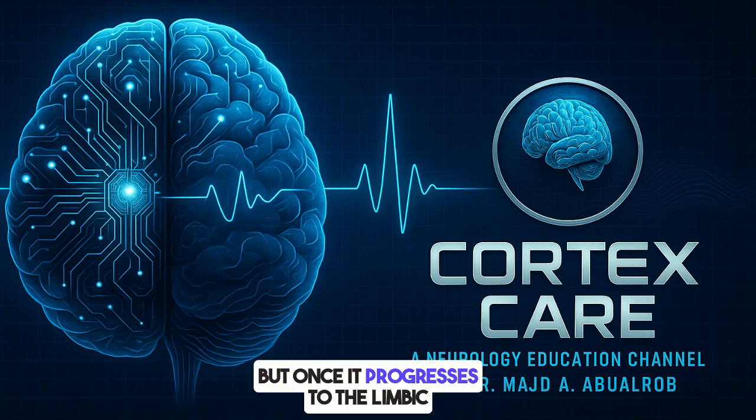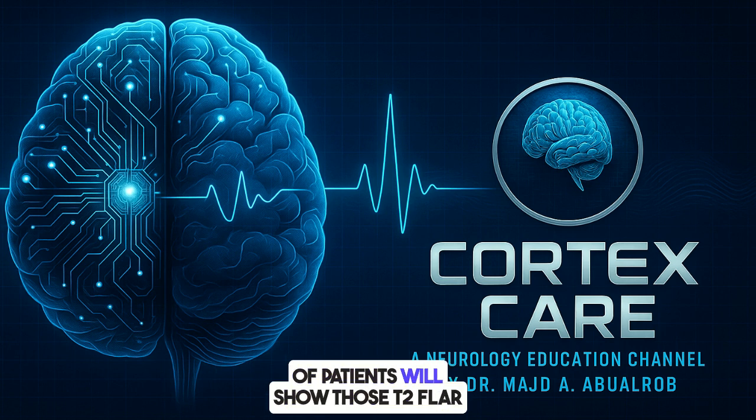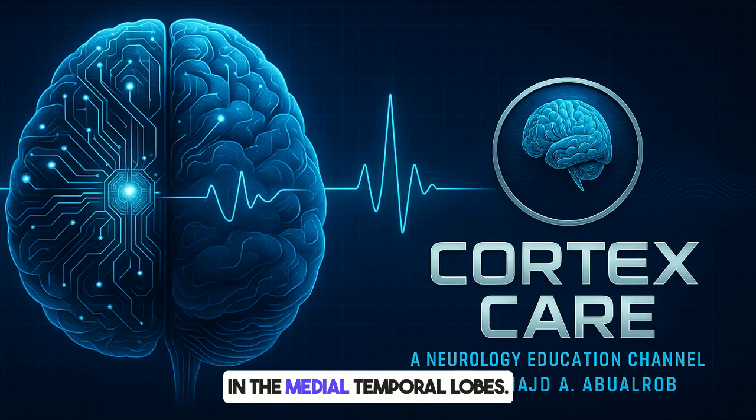Right. But once it progresses to the limbic encephalitis stage, about 60–70% of patients will show those T2-FLAIR hyperintensities, the bright spots, in the medial temporal lobes. Medial temporal lobe, so hippocampus, amygdala area. Exactly. Figure 2 in the paper shows a nice example of left medial temporal hyperintensity.